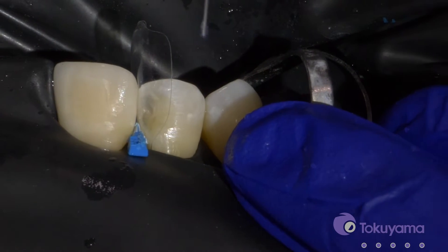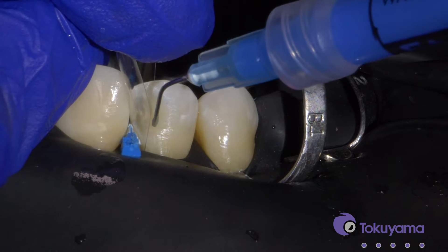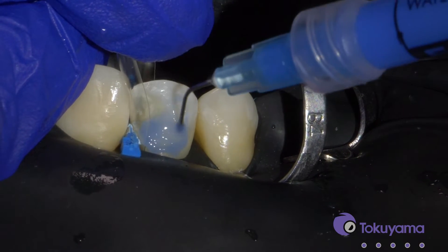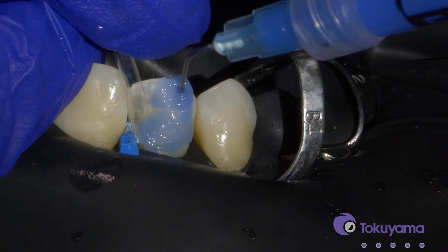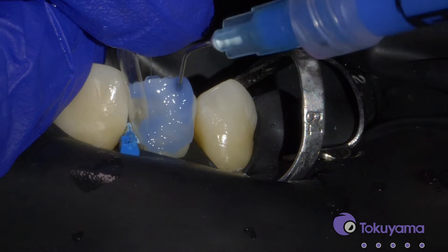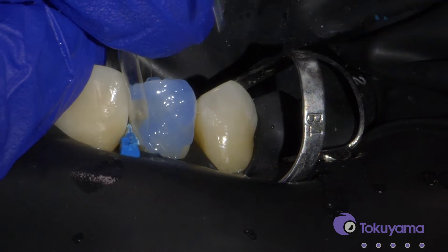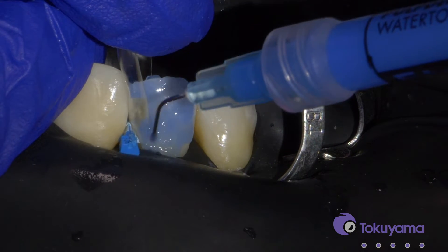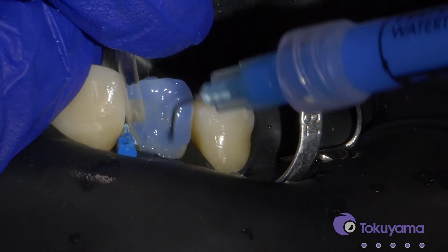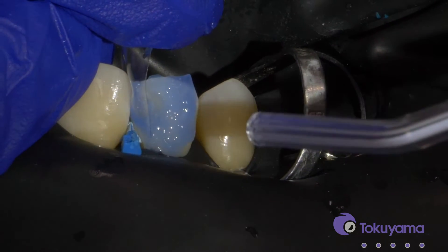So we're going to start restoring now. I'll start doing my selective etch on the enamel only, and I'll go really far beyond the edge just so I don't end up with a white line where my composite and tooth end. If you have an air abrasion unit, it's really great to use that right before you do this as well to just clean the tooth a little more. And let's wash it off.